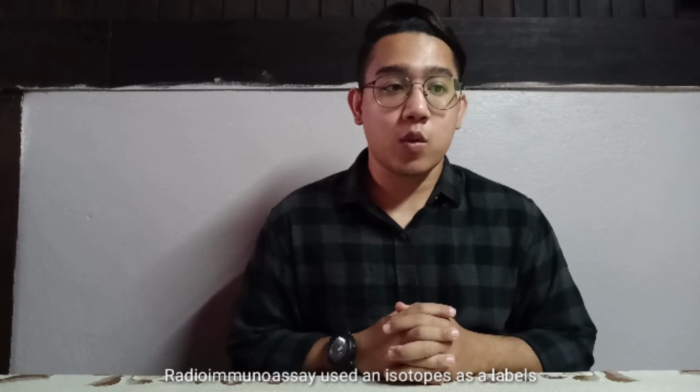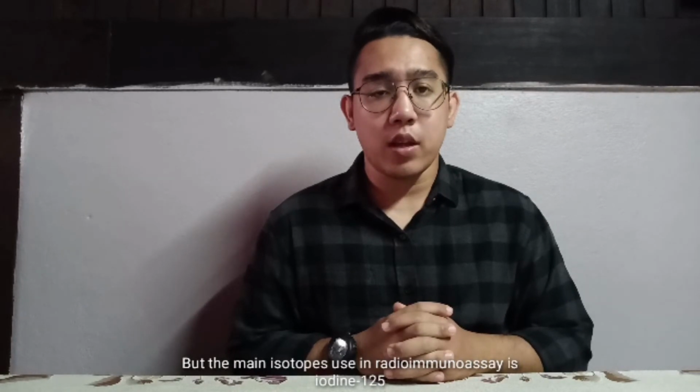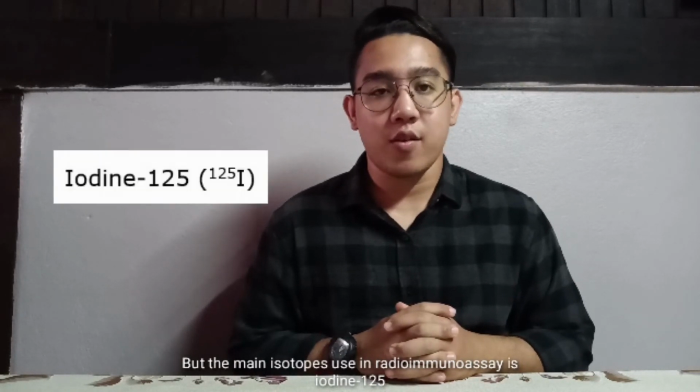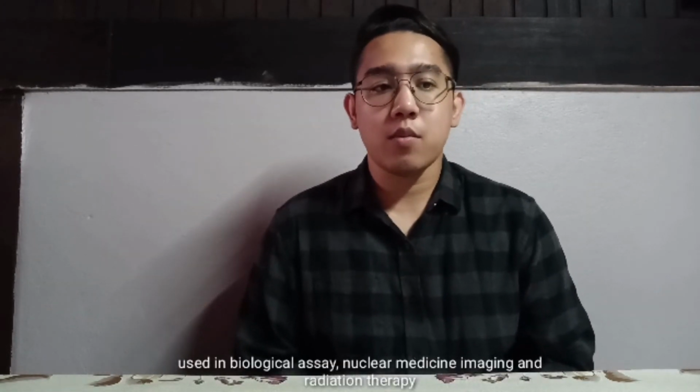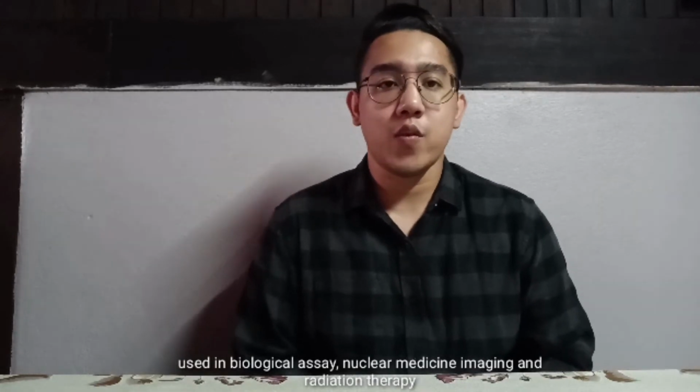Radioimmunoassay uses an isotope as a label. The isotope used in radioimmunoassay is iodine, such as iodine-125, iodine-131, and also tritium. But the main isotope used in radioimmunoassay is iodine-125. Iodine-125 is a type of radioisotope which is commonly used in biological assay, nuclear medicine imaging, and also in radiation therapy. That's all about labels in radioimmunoassay.